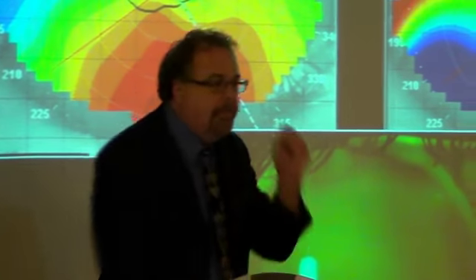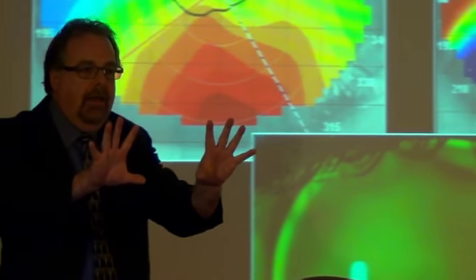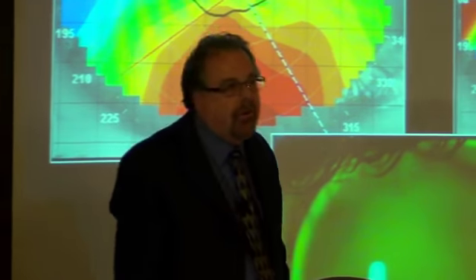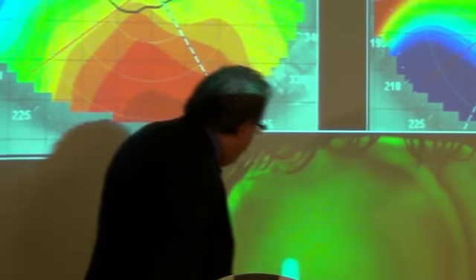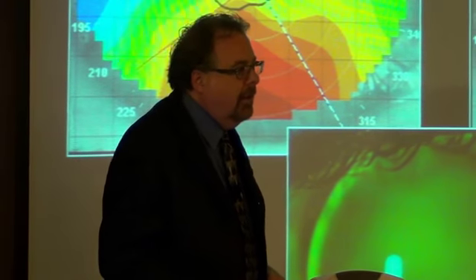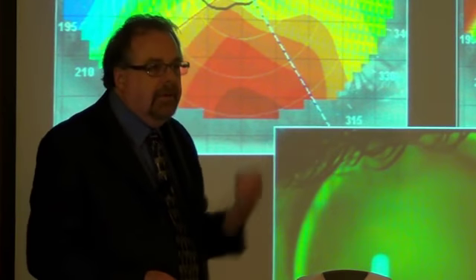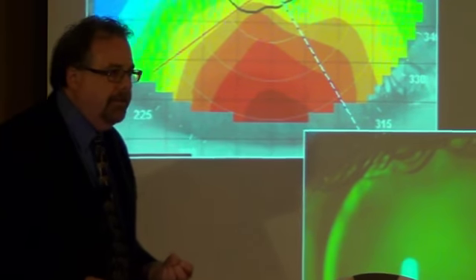the cornea, but notice how much the lens jettisons away from the inferior cornea, because now it's jettisoned far enough away that it's actually interacting with the lower lid. So now this is going to be an uncomfortable lens for the patient.